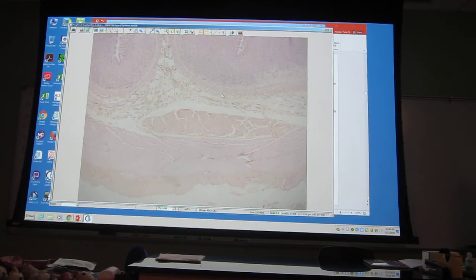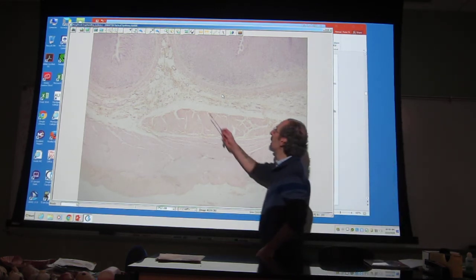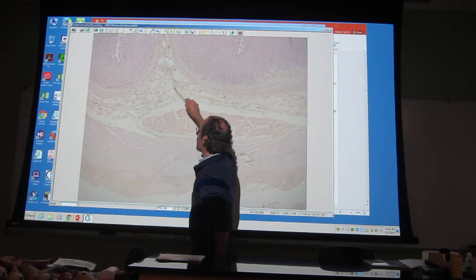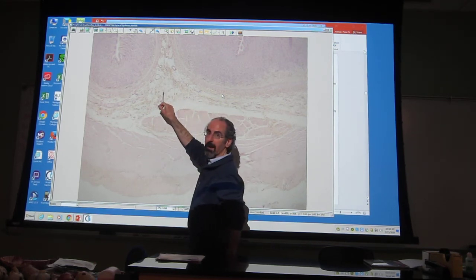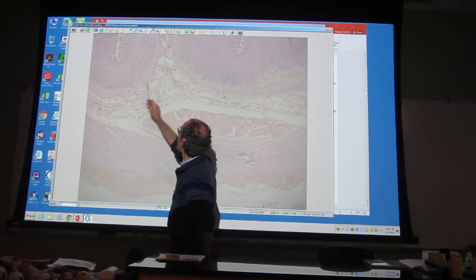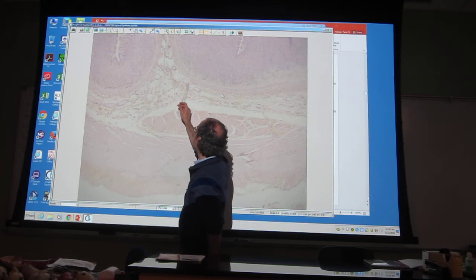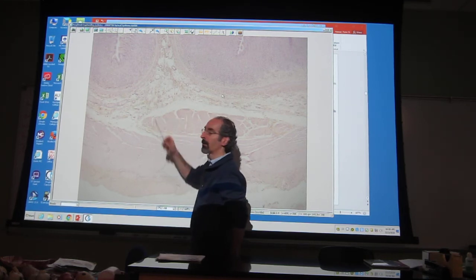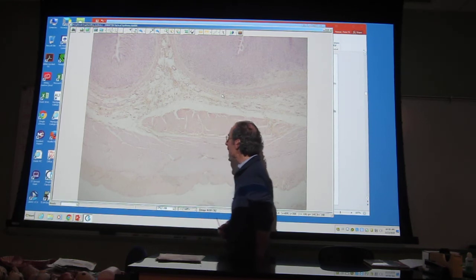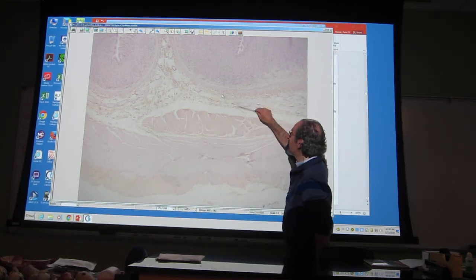As we make our way down, we can see the following. Here is the submucosal layer. So, here is the muscularis mucosa. So this is the base of the mucosal layer. All of this is submucosa. We call it the submucosal layer where you have a lot of blood vessels and nerves traveling through. So you would expect to see a lot of lumens like these. These are basically arteries, veins, and lymphatic channels traveling through the submucosal layer. And occasionally you'll see some nerve bundles too.